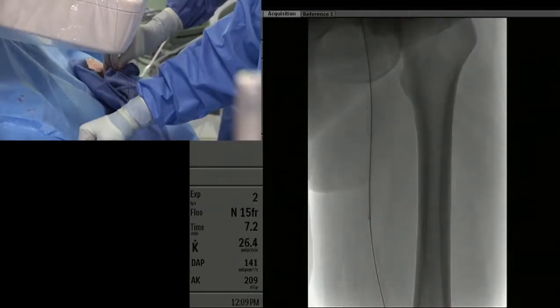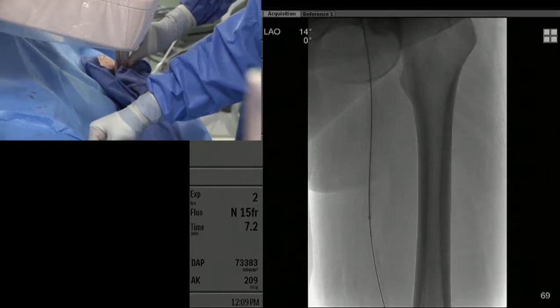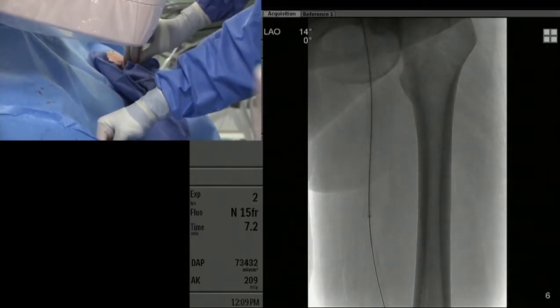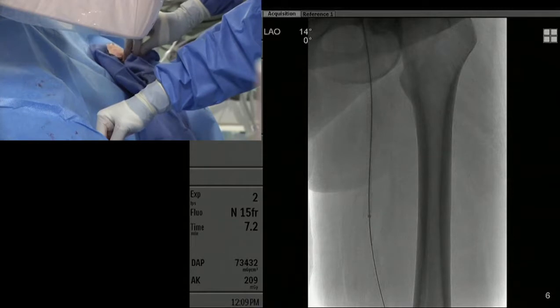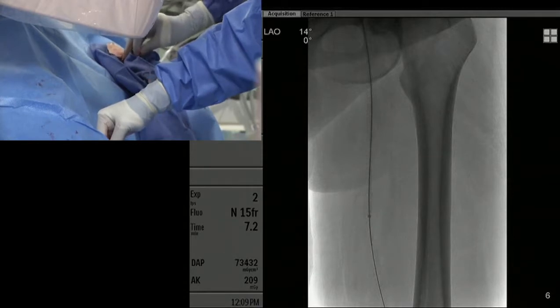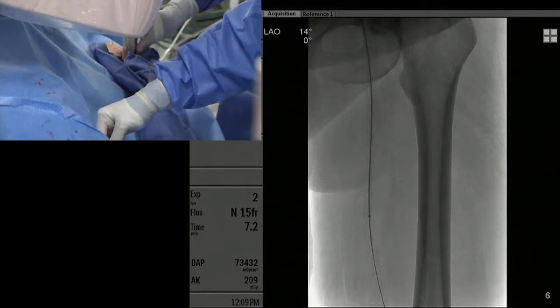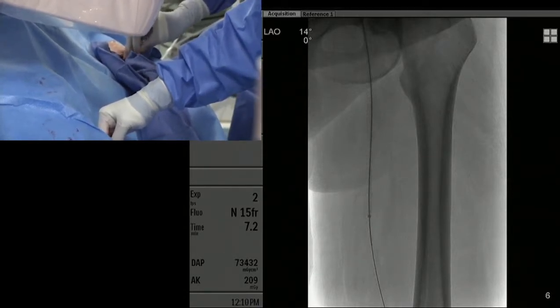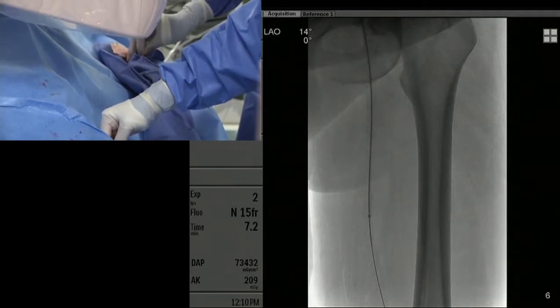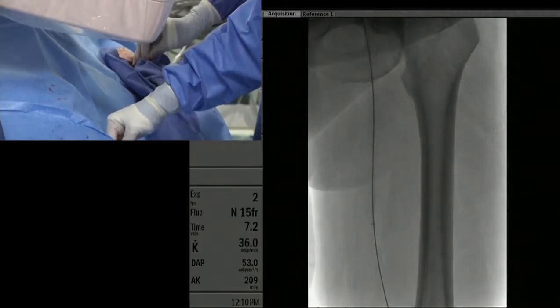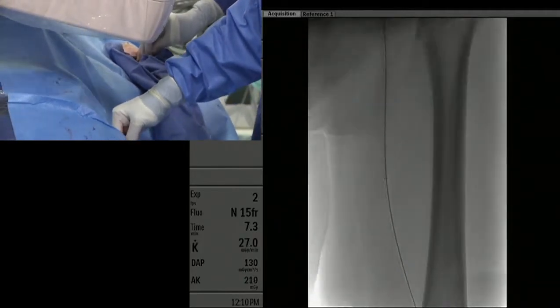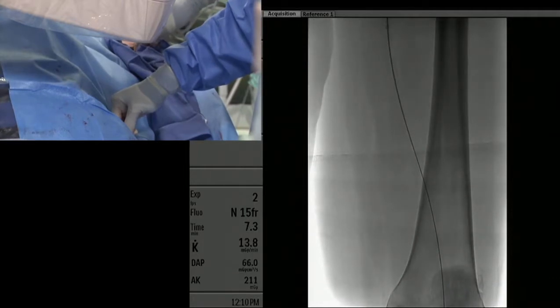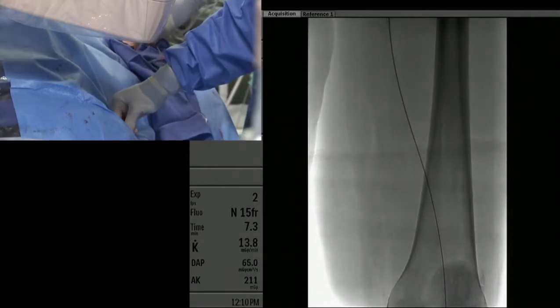You can see that this is the 5'6 slender sheath, which is actually 119 centimeters and is already at the mid SFA right there. So we have plenty of sheath in to be able to treat the area of disease.